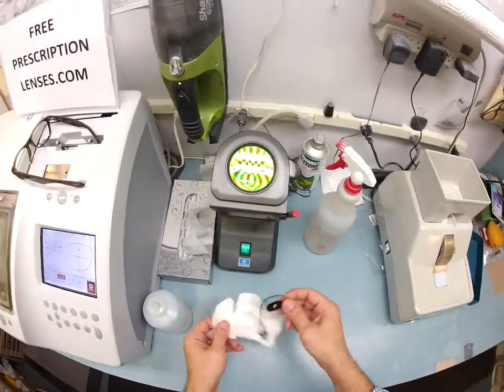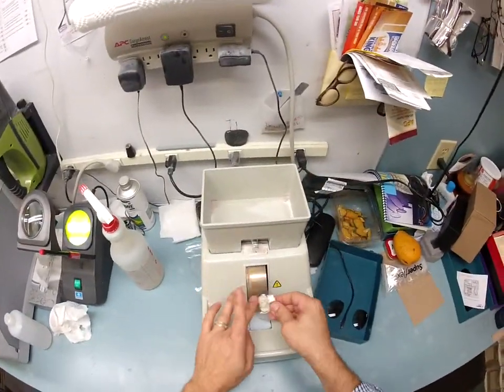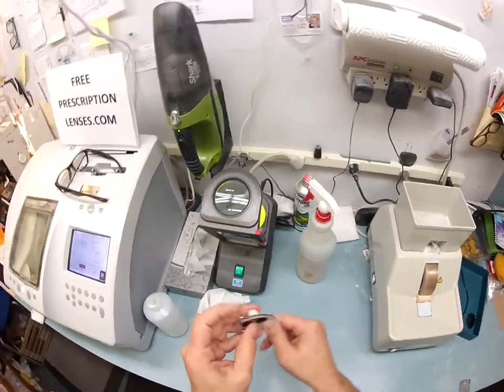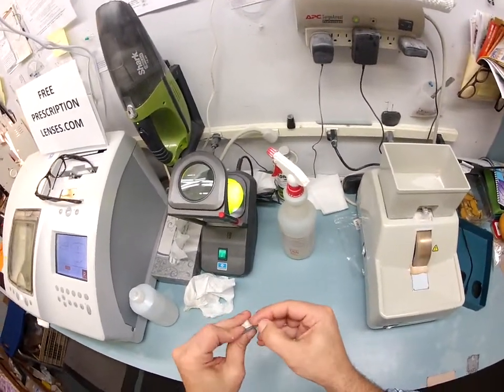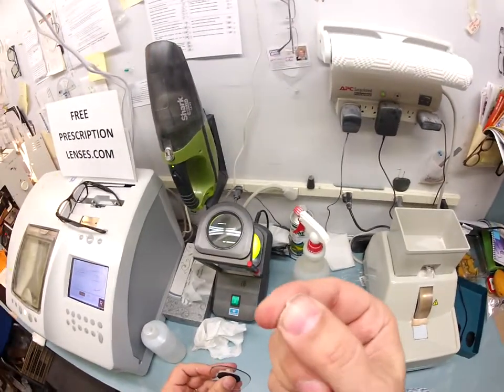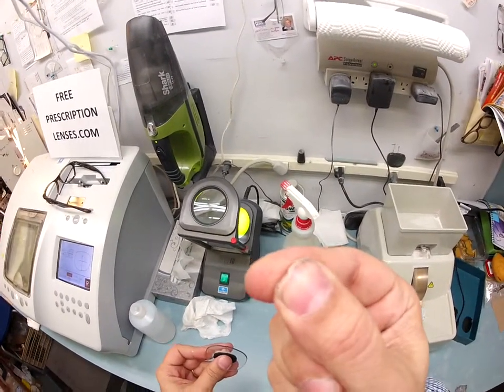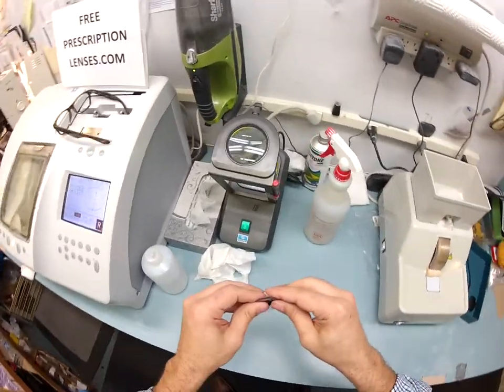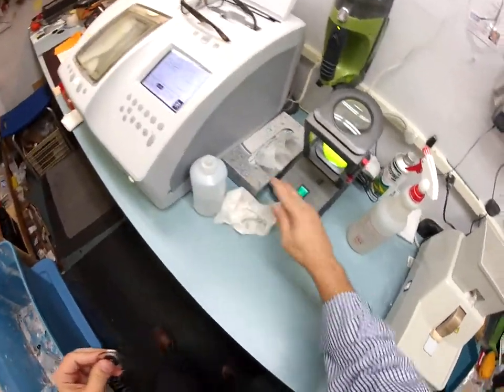I'm going to go back over real quick with a safety bevel on the handstone. And I actually do this so much in the course of a day that I have worn a V-shaped bevel into my thumbnail. My friends call it my occupational thumbnail because I sit there and scrape the sides of lenses. And again, once it's all on the counter, wipe it on the floor. Kids, stay in school. How many times do I have to tell you?